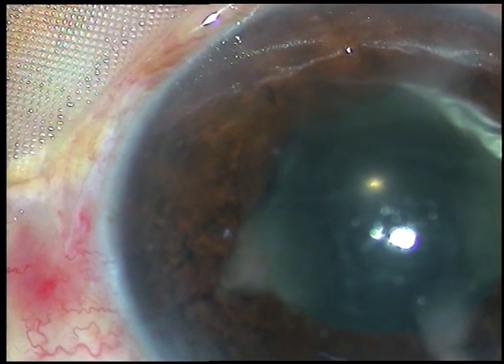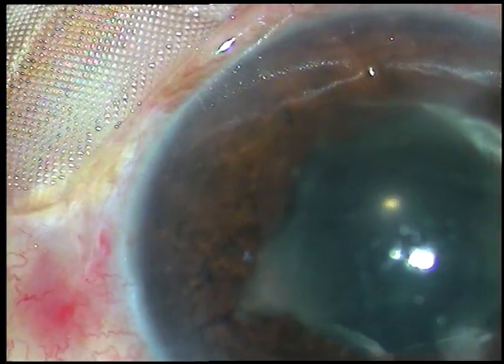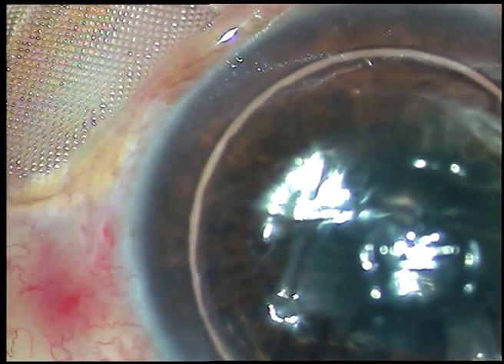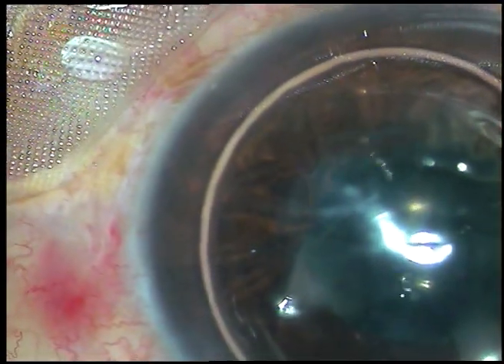Friends, we can see a thick fibrinous inflammatory membrane covering the pupil in this case. My plan is to remove this membrane. I have opened the wounds — the surgery was done the day before yesterday. Phacoemulsification with intraocular lens implantation has been performed.